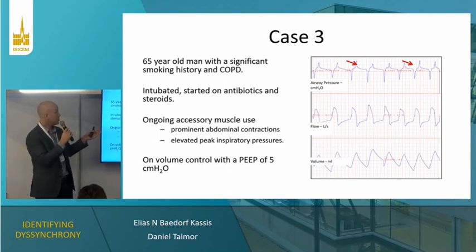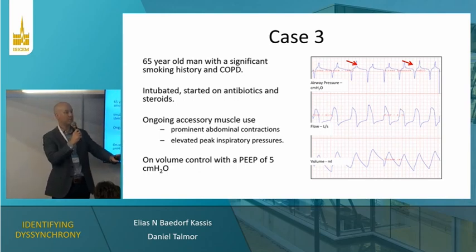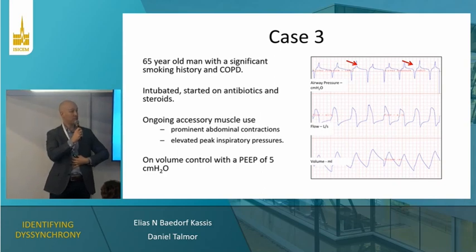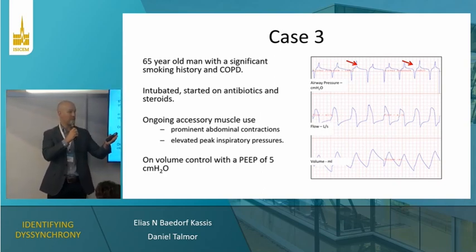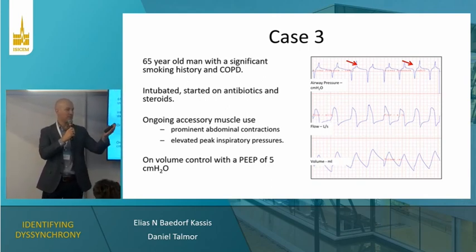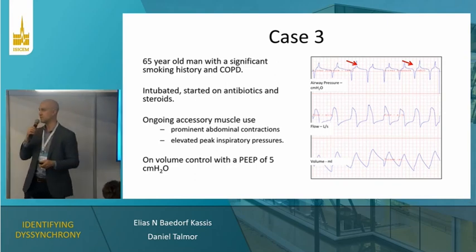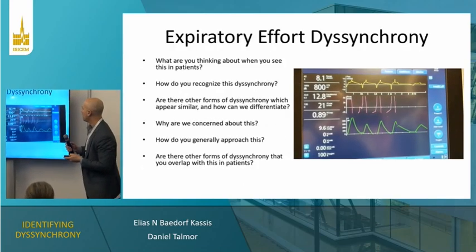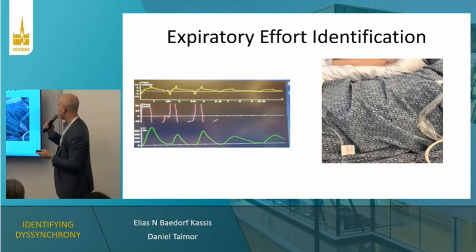Yeah, and I'll show you on the next slide how important it is to incorporate the clinical exam at the bedside too. If you see the patient actually having a Valsalva with each breath, bearing down, the sort of thoracoabdominal discordance, not just simple relaxation but also actual engagement of the expiratory muscles, then that's a good way of differentiating that phenomenon from this actual expiratory muscle activity. Okay, so I'll actually skip ahead to, here we go.